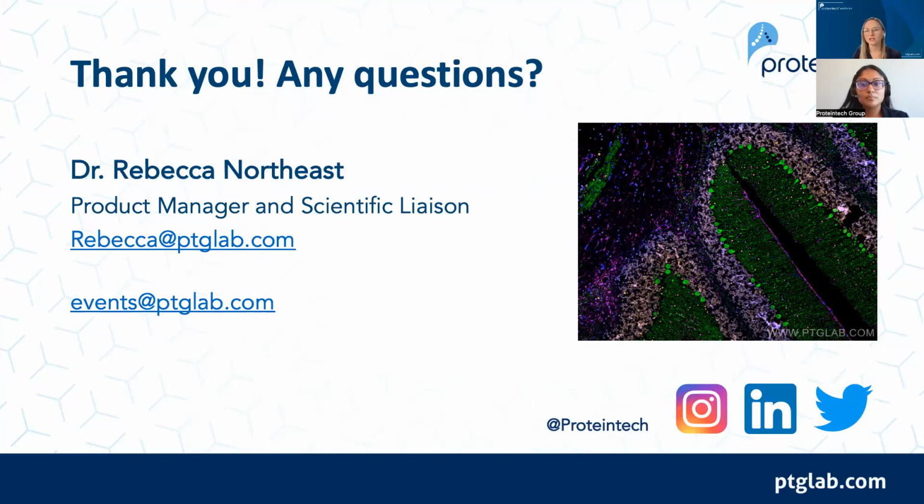So you first want to look at your extracellular and your intracellular protein sequentially, and then see perhaps PFA looks good for the intracellular, but bad for the extracellular, but methanol looks good for both the intracellular and the extracellular. So then you know that, okay, methanol is the way to go here. Try and figure out what types of protocols are best individually, and then hopefully they will merge together.